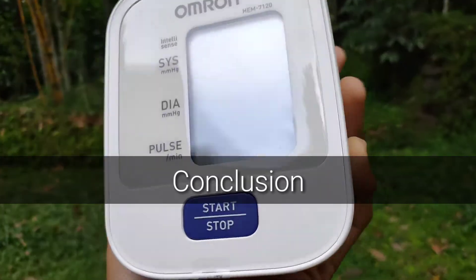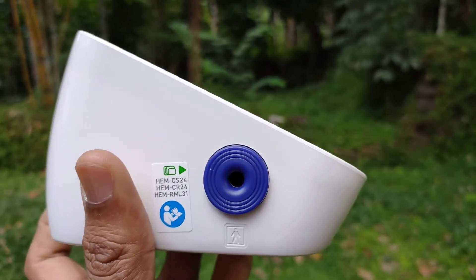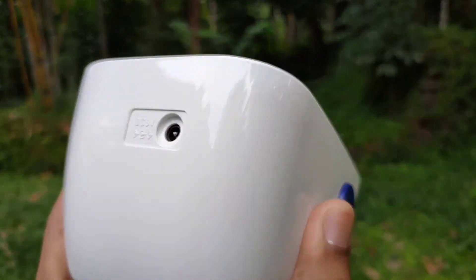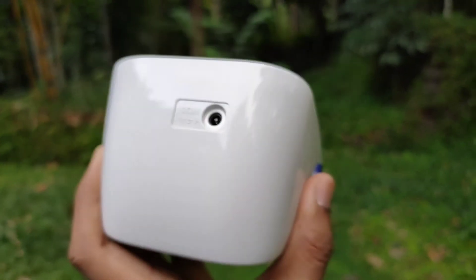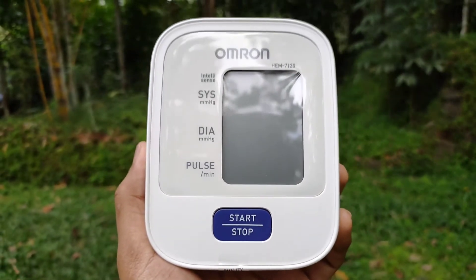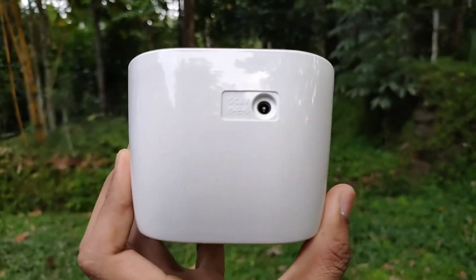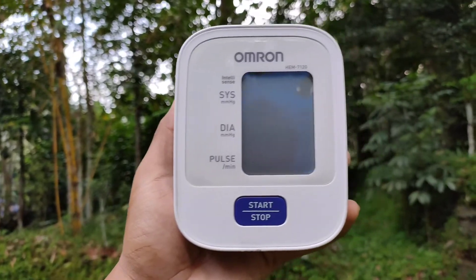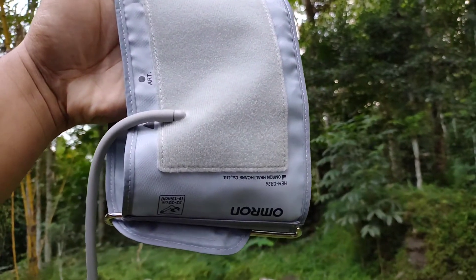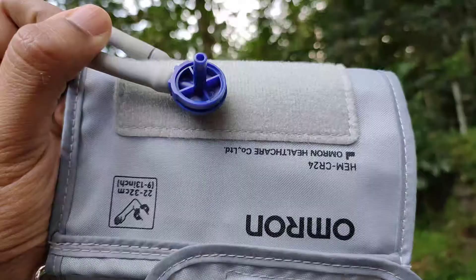I bought this blood pressure monitor for my parents and it was priced at Rs 1800. It's definitely a good product in this price segment and the values are more reliable than any smartwatch in the same price range. Build quality and construction is really good, but it would have been great if Omron provided a carry case or carry pouch along with it. The arm cuff is of latex free construction — it's made up of nylon, polyester and PVC. It feels good and the texture is just right for the purpose.